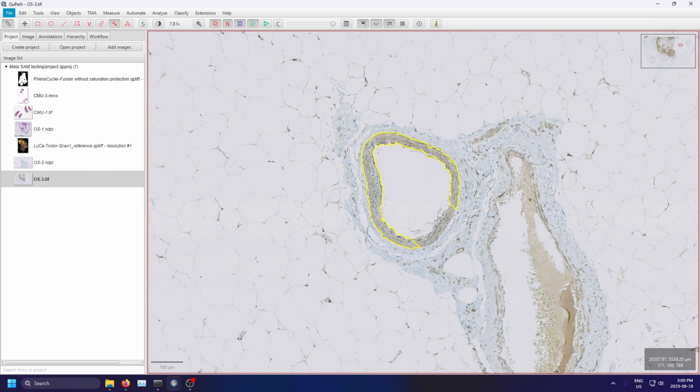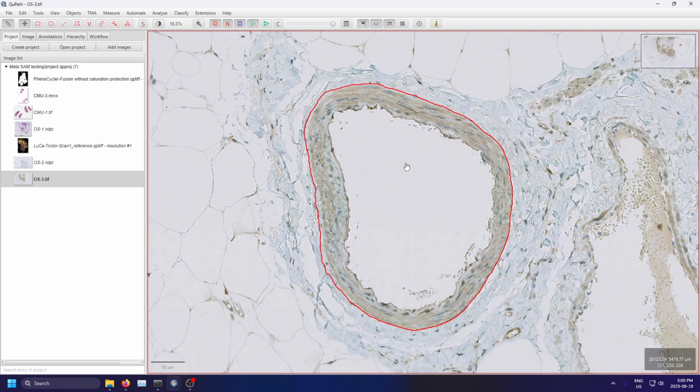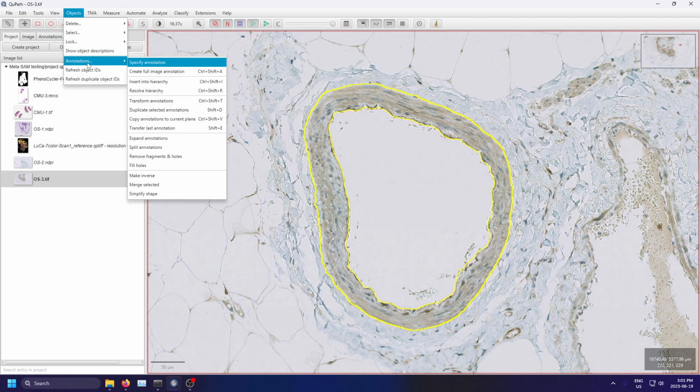So that was an example of me trying to do it manually. Wrong tool. Good. There we go. Yeah, SAM can do a reasonable job. And let's say we wanted to remove the lumen. I believe one approach to do this would be to draw a rectangle of the white space area. Now we have two annotations, and we can do something like a subtraction.